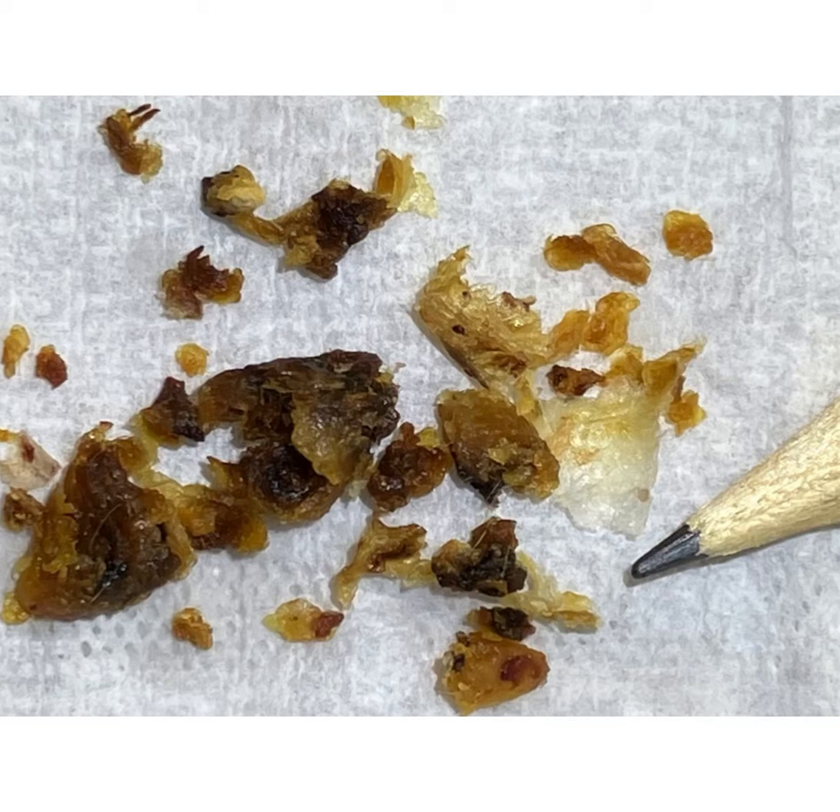And that's all the debris we've removed from both ears — you can see it's quite a big haul there. I hope you enjoyed that video. If you are interested in the Waxscope, please email info@clearwax.co.uk. Thank you. Bye.